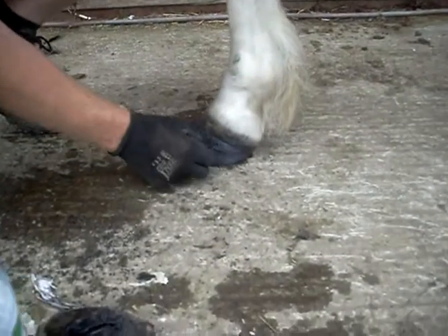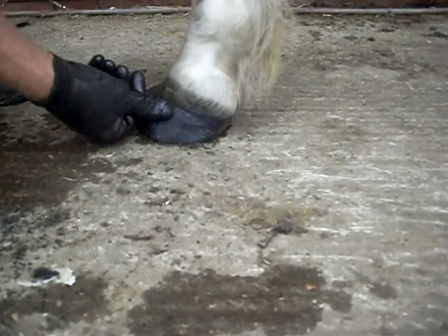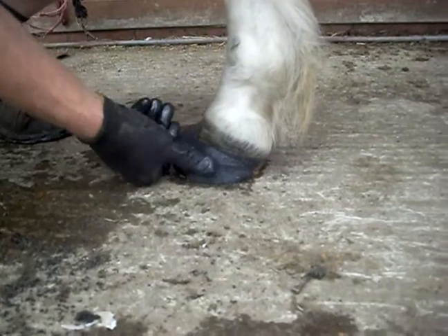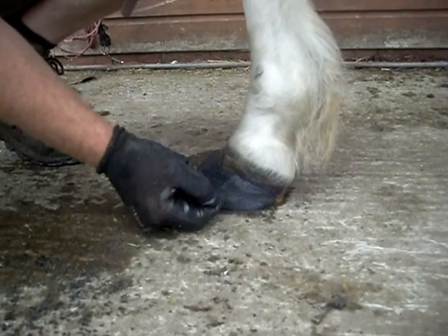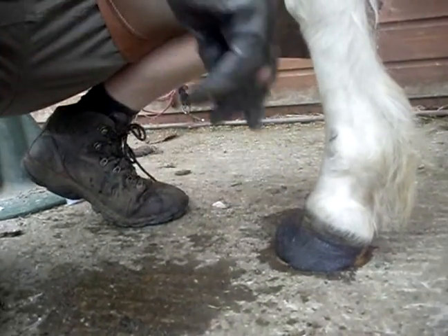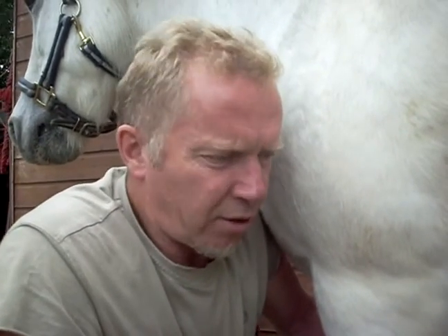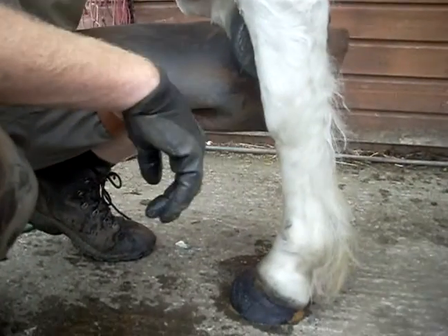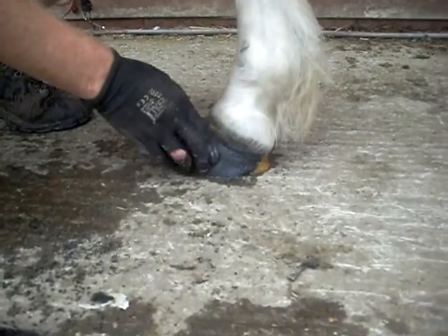If you get it to finish on the bottom, it's a lot better, but if not it doesn't matter because it'll just push in there and set like that. And if you do have a loose flappy bit, once it's set, you can just cut it off or rasp it. The hoof cast goes off very much to the strength of the hoof, so if you want to, you can actually nail a shoe onto it. It rasps very much like the foot as well, so it doesn't matter how broken the foot — if you put a hoof cast on, you can nail on top of that. This is a different application today because obviously we're dealing with a laminitic situation.